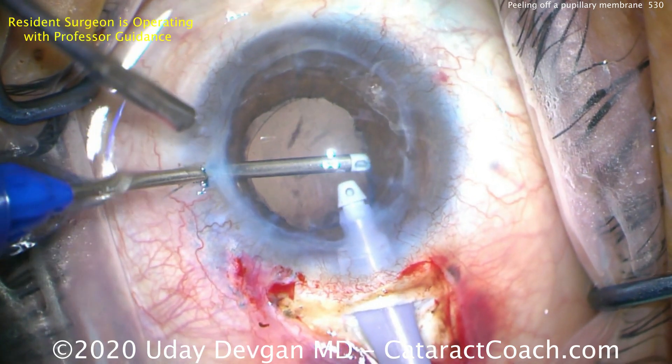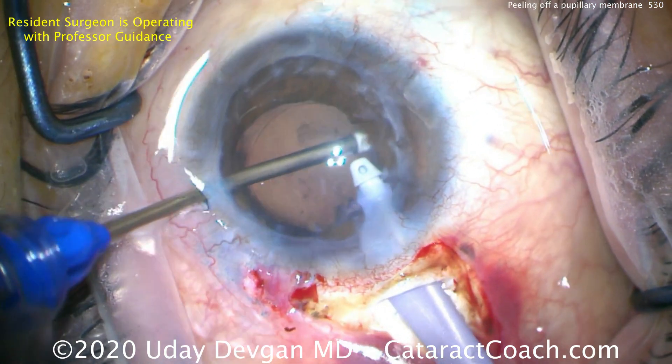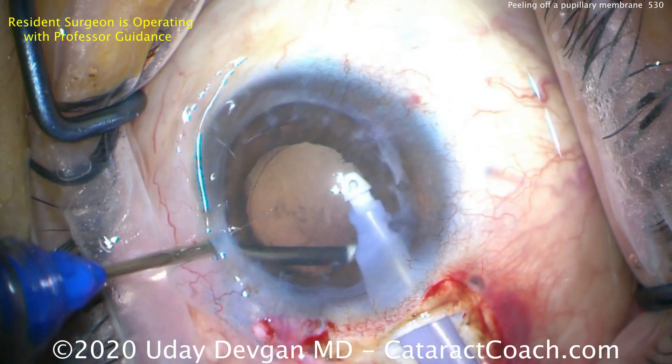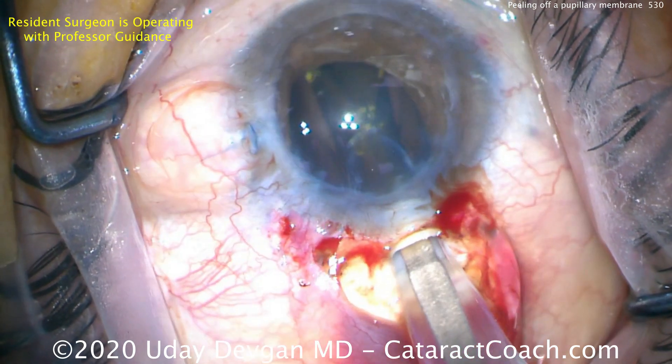Everything so far looks pretty good. We definitely want to control inflammation in the post-op period for the survival of that graft, plus we had a lot of iris manipulation which may induce additional inflammatory processes, so we want to control that. Here comes our lens — a single-piece acrylic IOL going into the capsular bag nice and easy.